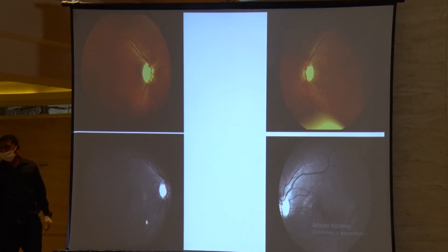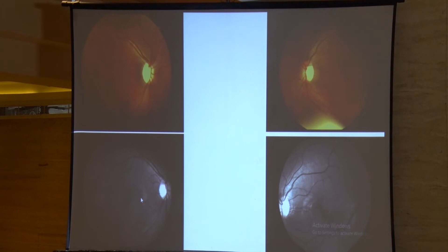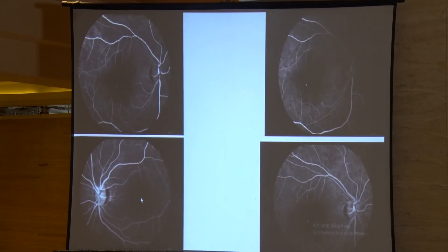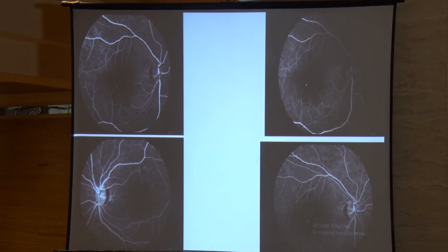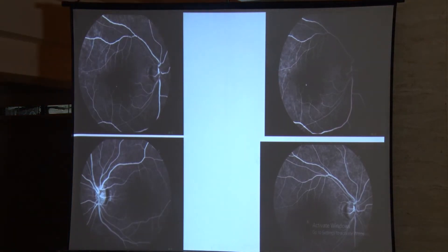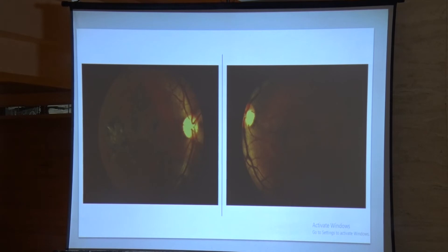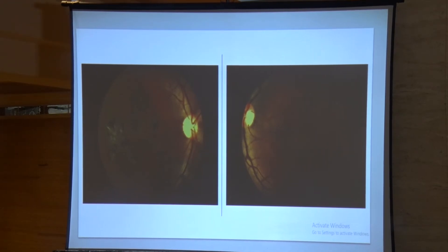On serial frames, going from early to late phases, you can see there is definite leakage — something you cannot get on OCT. OCT cannot pinpoint leakage; there are markers showing more than 90% correspondence, but you cannot go and laser based on OCT alone. This is particularly relevant in cases of CSR where pinpointing the leakage point is essential before laser treatment.